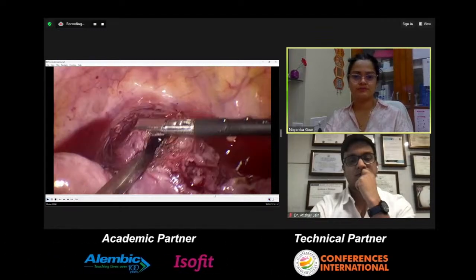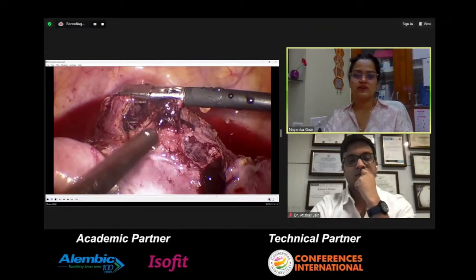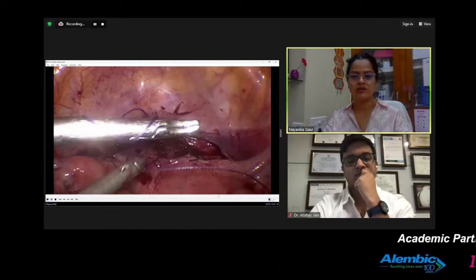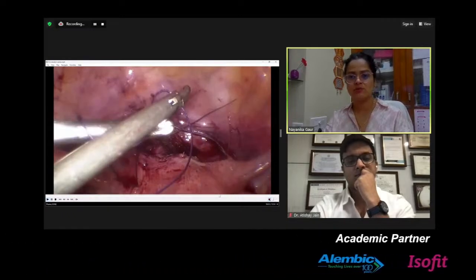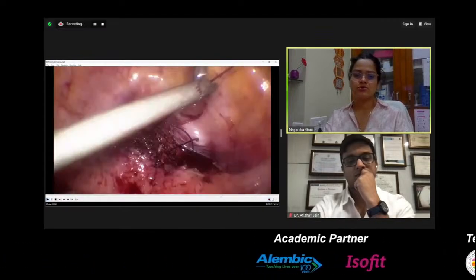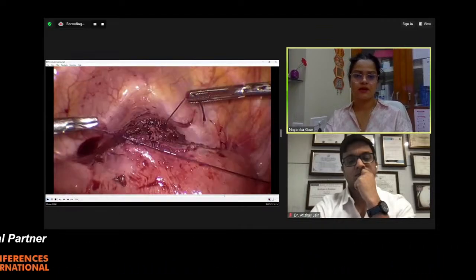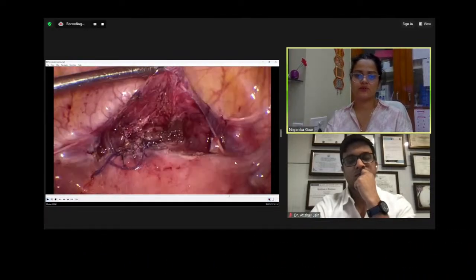And after cleaning, we decided to suture it laparoscopically. So these patients where scar ectopic is seen are very comfortably managed with laparoscopic management. However, in this patient it was not technically a complete excision through laparoscopy, because she had already undergone a suction and evacuation vaginally. Here the rent of the uterus was sutured with Vicryl number 1 in 2 layers. Complete hemostasis was achieved, and this was the final view of the picture.